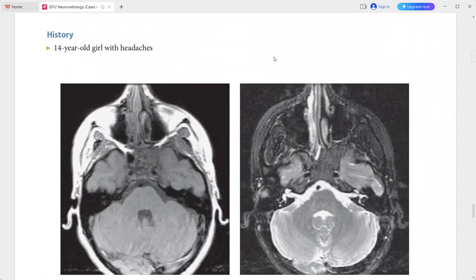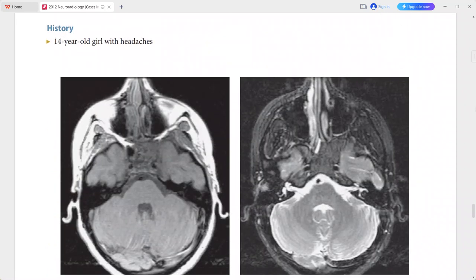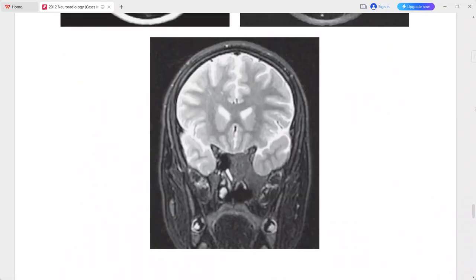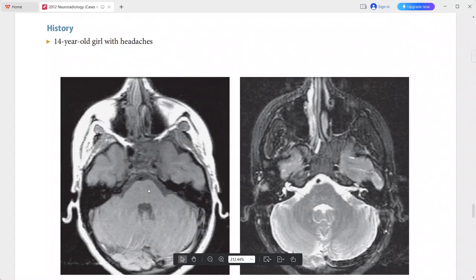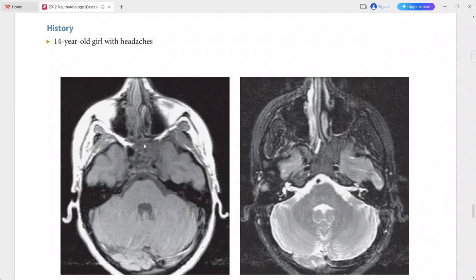Next is a 14-year-old girl presenting with headaches. On T1-weighted MRI, there is an abnormal area that is hypointense on T1 and also hypointense on T2 fat-suppressed MRI. The area of signal decrease is largely homogeneous.